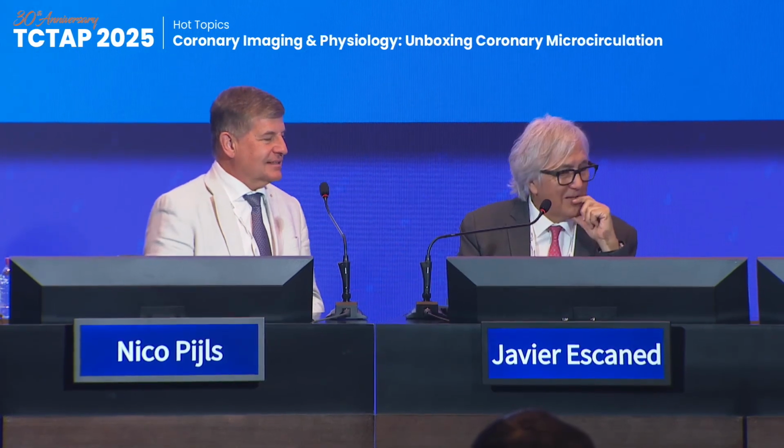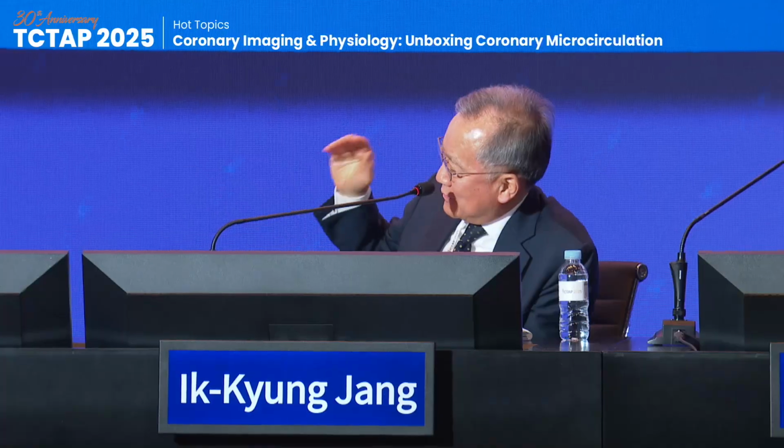If I can ask a question to Dr. Kubo. In a MINOCA patient, you do a cardiac MR and OCT. And oftentimes, in my experience, we discover ruptured plaque, but very small, without real evidence of recent thrombus. So the positive troponin, is it really from the small plaque rupture, or is it an incidental finding?